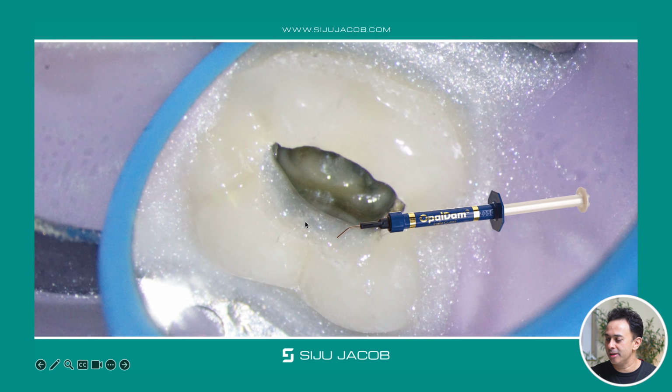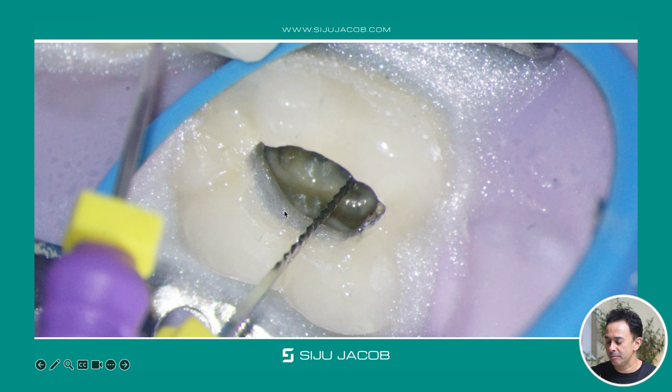So we need to prevent this, and the easiest way to prevent this is by using a gingival barrier to cover the exposed metal surfaces. And once we put a layer of gingival barrier or opal dam, then the file no longer contacts the metal surface. It contacts the gingival barrier instead. So this is a very easy way to solve this problem of the apex locator giving you erratic readings when the file contacts metal surface. Just cover the whole metal surface with a gingival barrier.